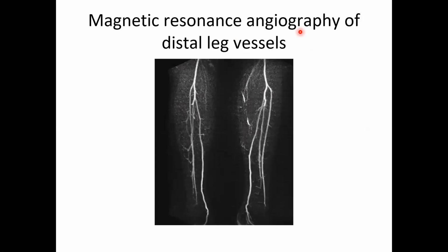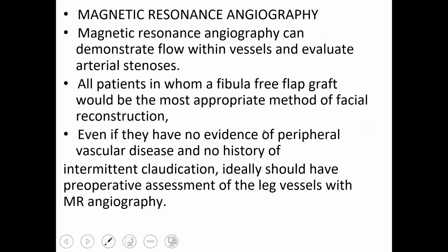So MRI angiography of the distal leg vessels. You could see the distal leg vessels. MRI angiography is one more application of MRI.